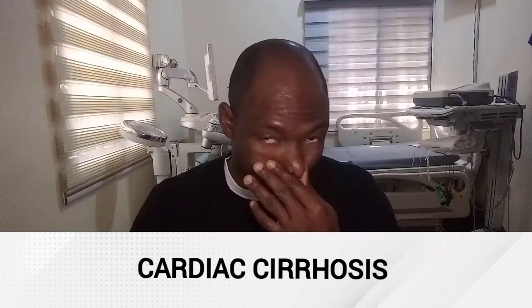This may be the earliest sign of cirrhosis in about 75% of cases. The sonologist should be alert to this situation, since this may be the first indication that the problem is cardiac rather than hepatic in origin. In progressive CCF, the liver will be damaged, resulting in cardiac cirrhosis. The IVC will have an increased diameter and will no longer be influenced by respiration.